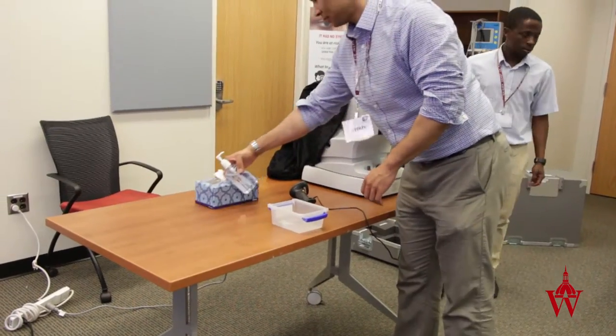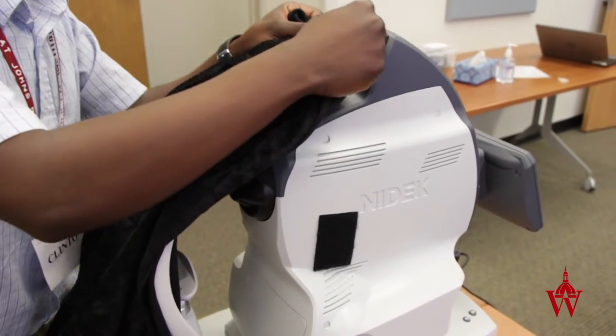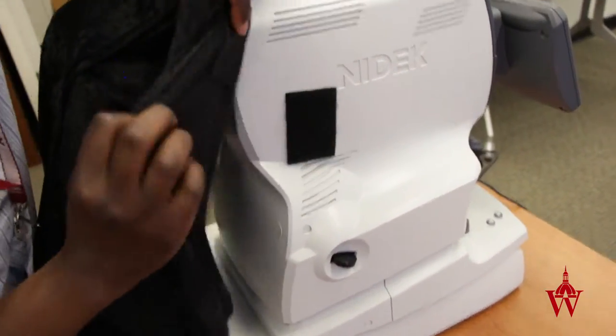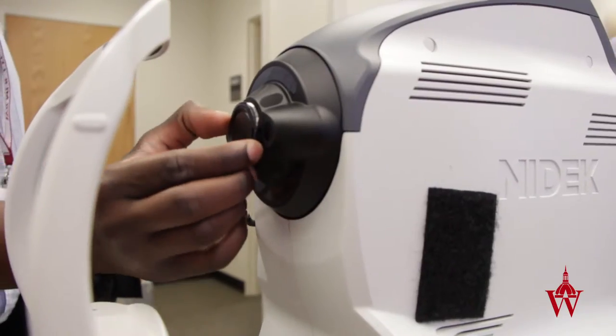Set up the table with hand sanitizer, alcohol wipes, and tissues. Attach the black drape to the camera using the Velcro. Turn on the camera and remove the lens cover.